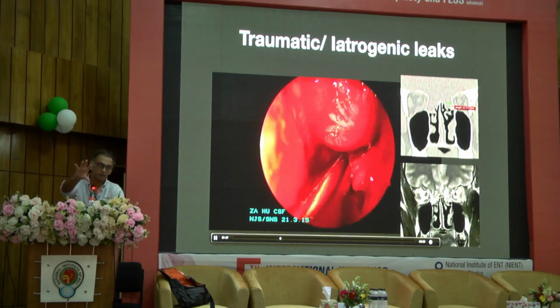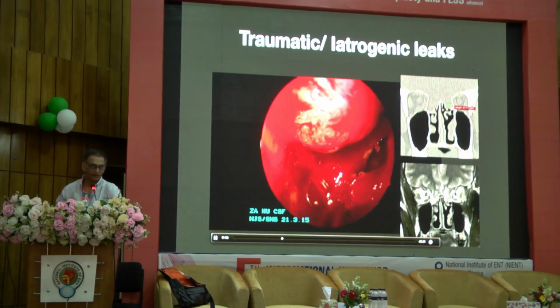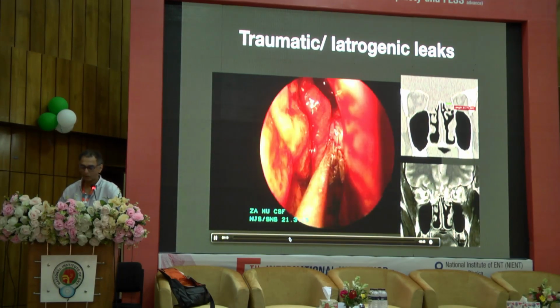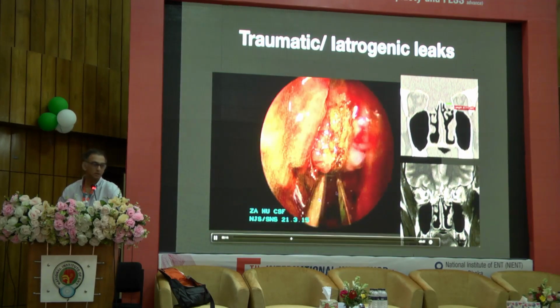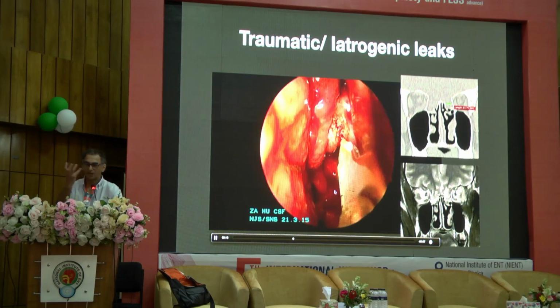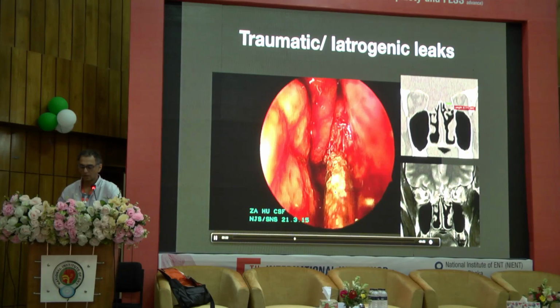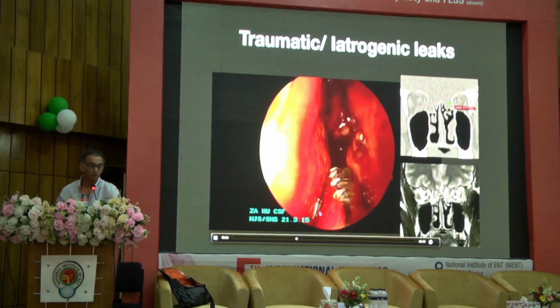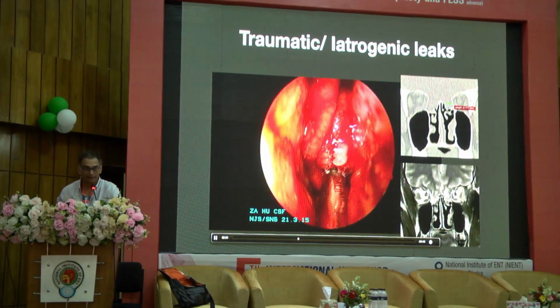So now we take a bipolar and we try and shrink this encephalocele. When we do that, there is no difference at all. It just doesn't shrink at all. It's just hard. So then I take a knife thinking maybe the outer part is hard and inner part is soft. Still no difference. Nothing moves. So I have no option but to take a debrider now and debride it away, because if I don't find that bony edge, I cannot do a repair. Right? So we are debriding.